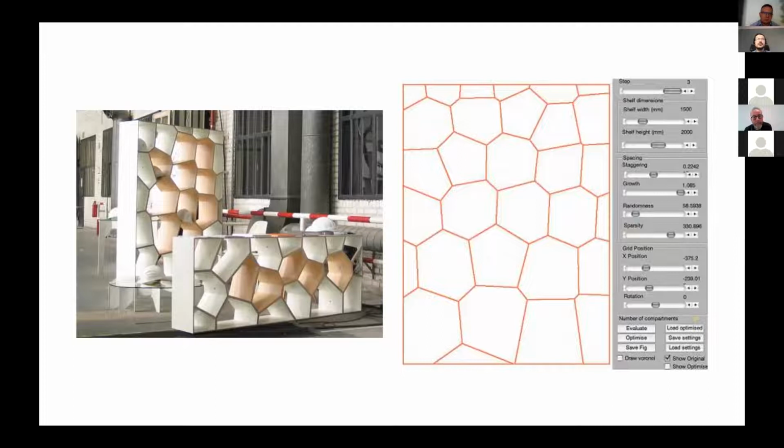Initially, we looked into production methods that were not additive in nature, but rather more traditional, although controlled by digital methods, of course, such as CNC cutting of wood, as you see in this example here. And this example is a mass customization tool that we developed, a software for building your own bookshelf, basically.